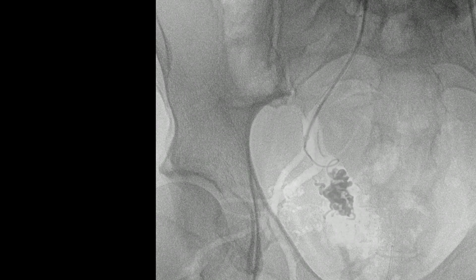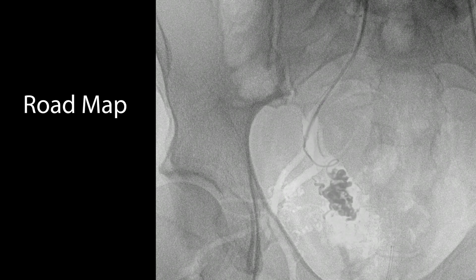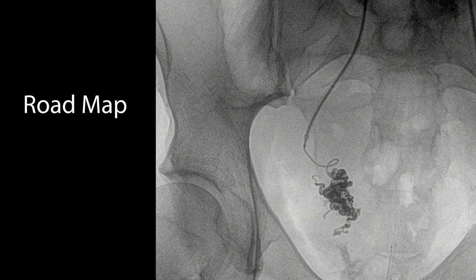As long as it keeps going antegrade, you essentially keep going. What you're always watching for is backing up around the delivery catheter. It's not supposed to glue in place the way glue itself does. If the vessel is very tortuous and the catheter gets a little stuck, the reason you need a sheath there is so you can do injections. Once you start getting a lot of onyx in there, it obscures new onyx — so use the roadmap function. Using roadmap is a very useful technique both for coils and for onyx delivery.